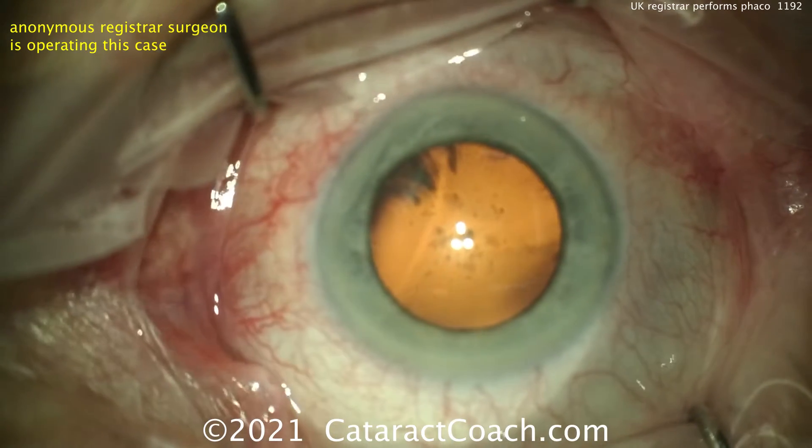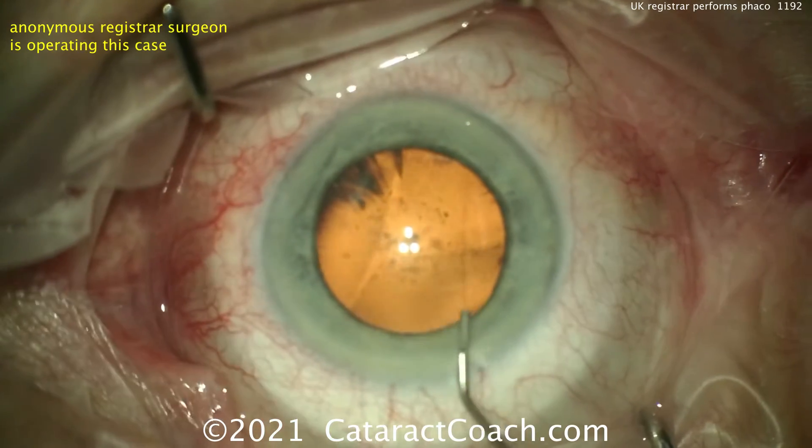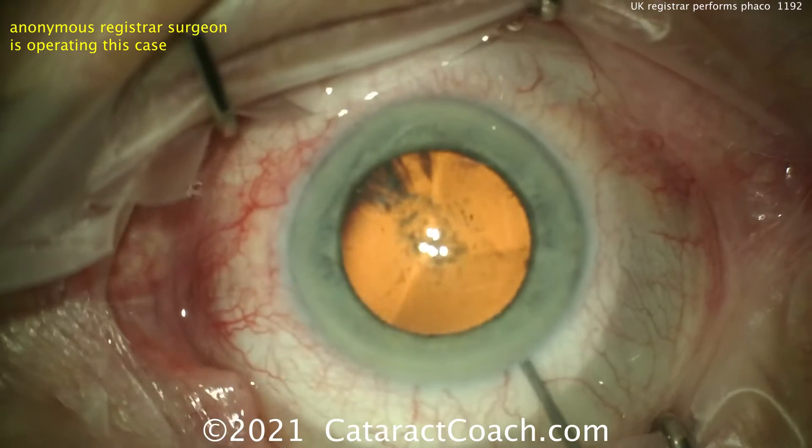Let's give some feedback here. That incision's pretty good. Looks like it could have started a little bit closer to the limbal vessels. I like to nick those limbal vessels. So here, the first incision's being made — the main incision — then an anesthetic is placed.